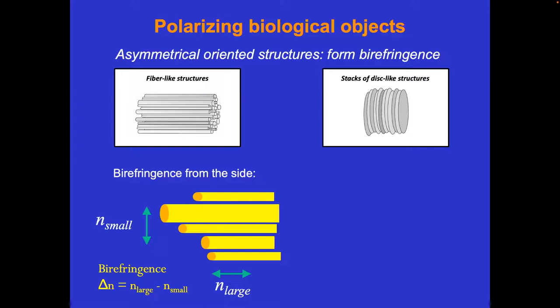And now it's very interesting, because when you can calculate it exactly, you know the phase of the field that's scattered off the cylinder. Then you look at the phase for this polarization state and this polarization state, and the scattered field has a slight, small phase shift. That's the effect of birefringence.